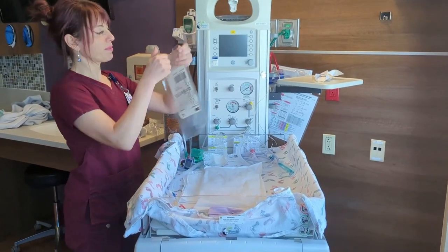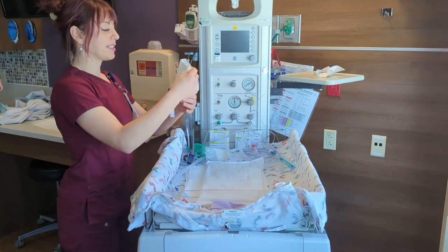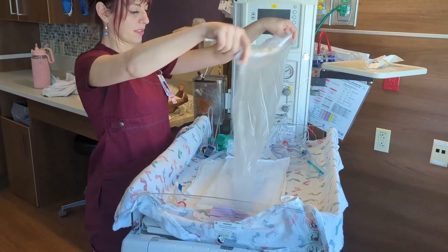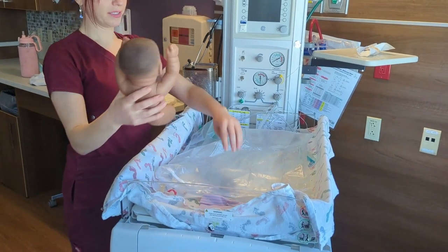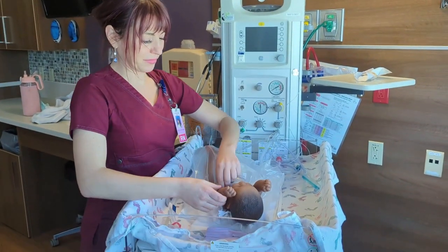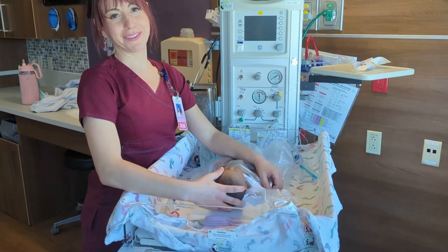The other thing we're going to do to set up for this small baby is a polyethylene wrap or bag like this one. When our small baby comes out, it can be wrapped up — keep those arms in. You'll never wrap around the infant's face.